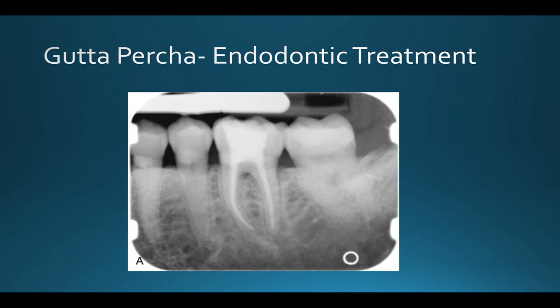So next, going over endodontic treatment. When you have endodontic treatment, typically there are two different materials that you're going to see used for the root canal. That could be either gutta percha or silver points. Gutta percha is a rubber-like material that's used to fill the canal of a pulp. Compared with other metallic restorations, it's a little bit less radiopaque, but it's obviously more radiopaque than the pulp chamber would be. This is the one you'll most commonly see.